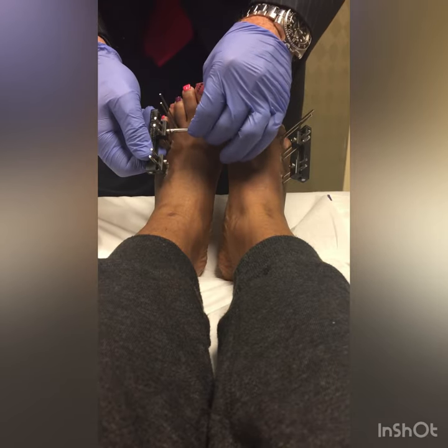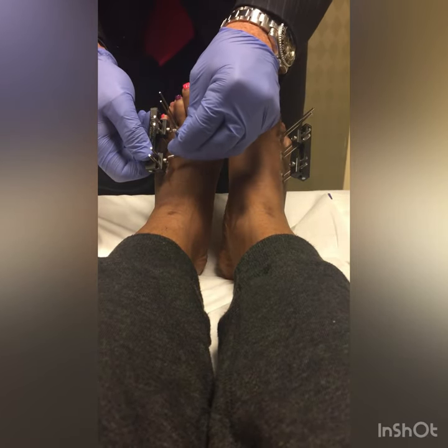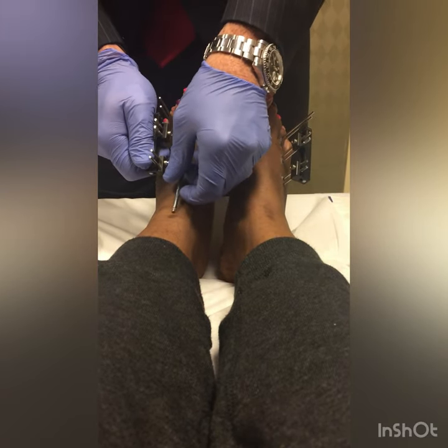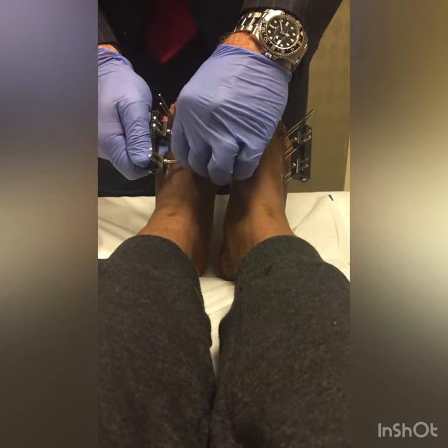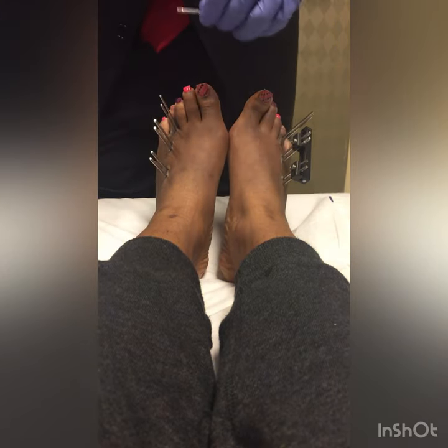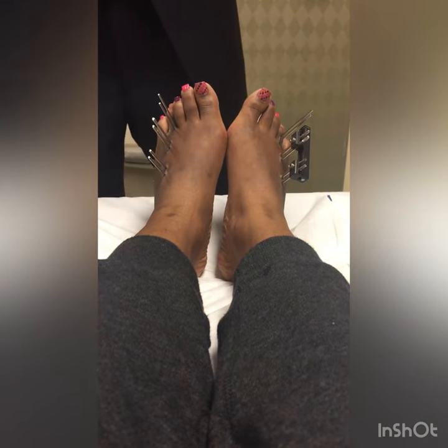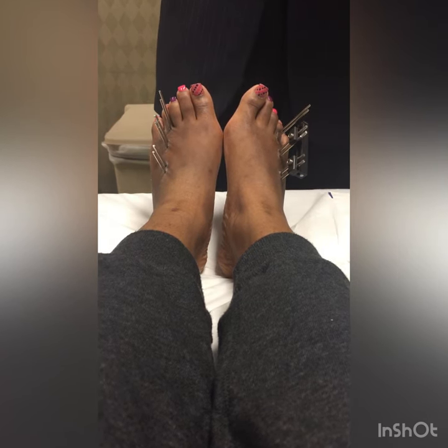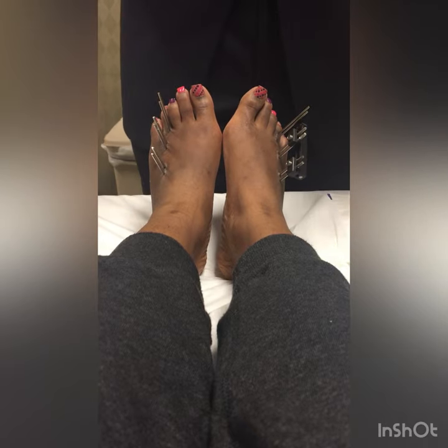It's the biomechanical mechanism that is the problem. What happens is it drags bacteria into the wound. If the skin rides up the pin and grabs any bacteria and then pulls it back down, that's the problem. Because of that pistoning, the skin isn't sealed to the pin, and that's what creates things to get in and get infected. So if you can create that skin-pin seal interface, you avoid pin track infection.